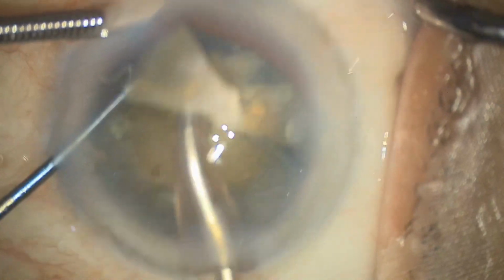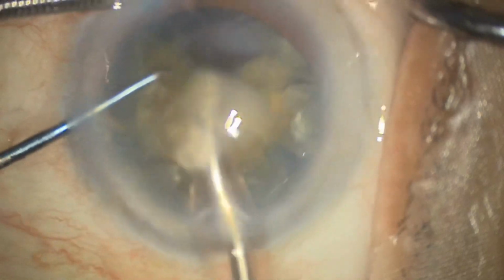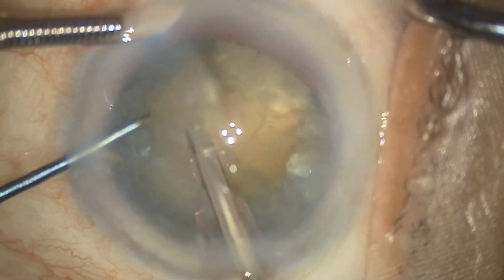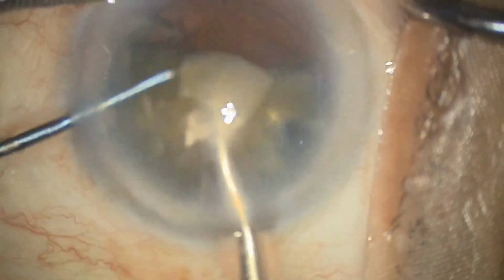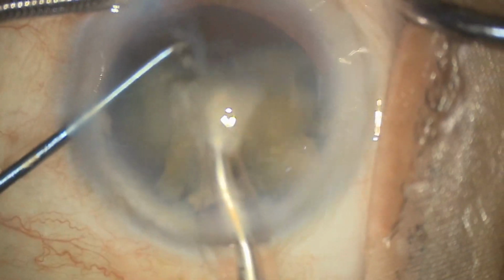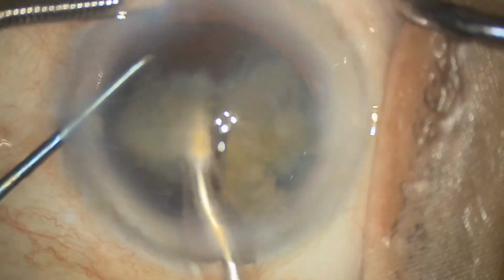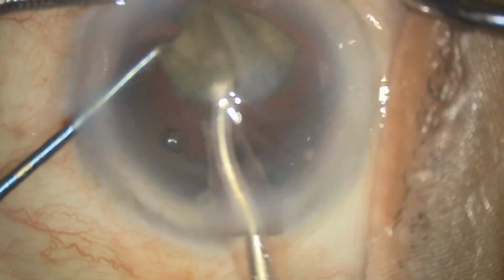In fragment mode, you use only torsional phaco. Because of the torsional phaco, there is no repulsion, so every time your nucleus piece remains around your phaco tip, and there is no need to chase the piece. Also, phaco burn is very little, and this way we minimize the phaco energy, because there is no cortical material to take care of when removing the last piece.